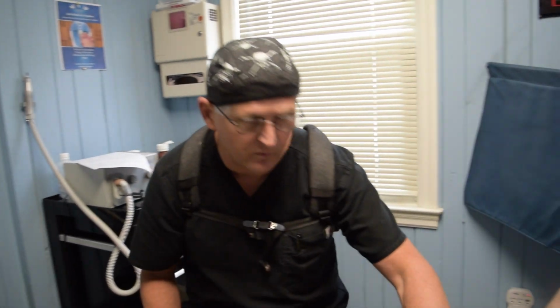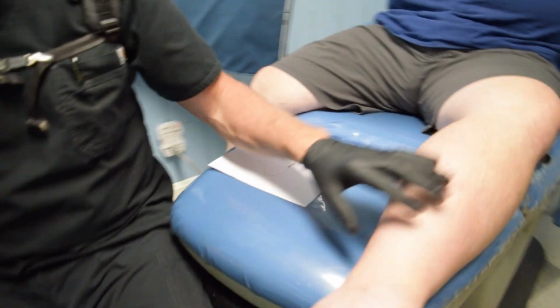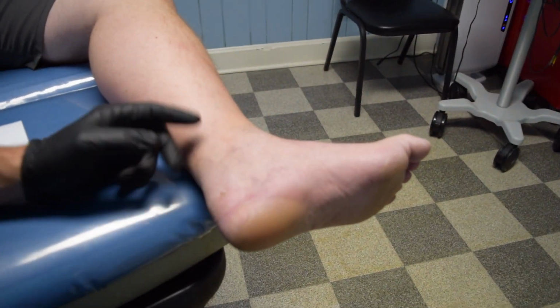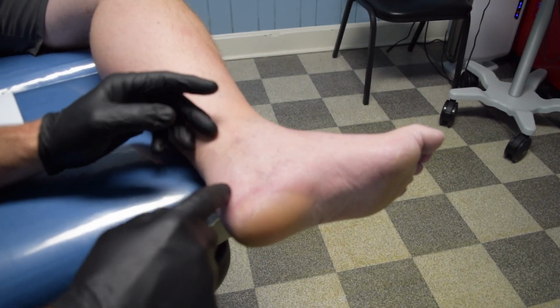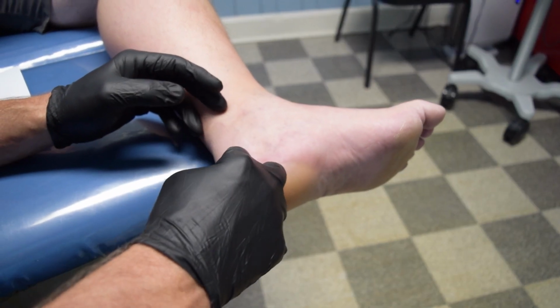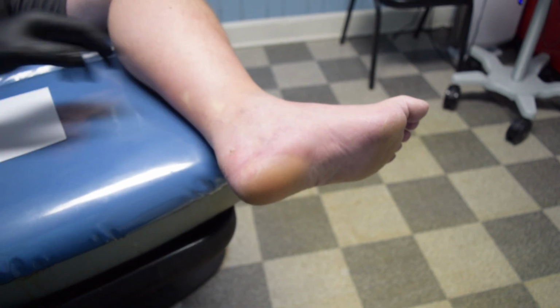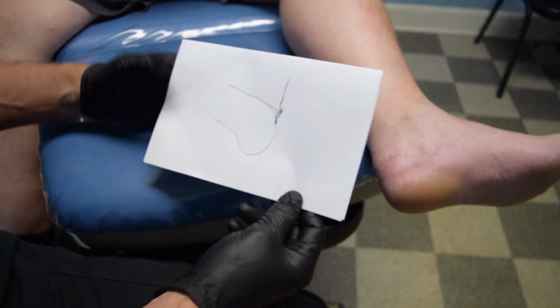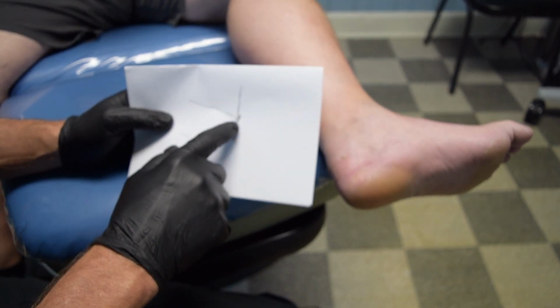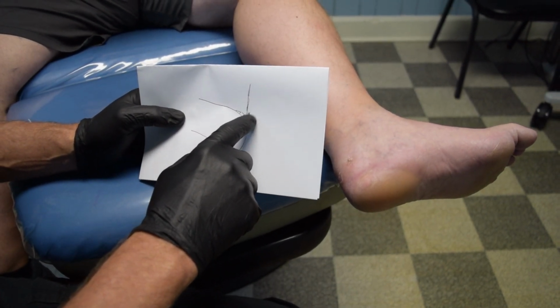So basically a patient with a heel spur in the back of the heel is going to have an underlying Haglund's deformity, which we address by making an incision here, and on the outside these are percutaneous incisions, and we reduce the basic Haglund's portion. So if you were to look at the back of someone's heel that had a Haglund's deformity, it's a little lump up here that interferes with the tendon moving properly. He also has a spur on the outside portion.